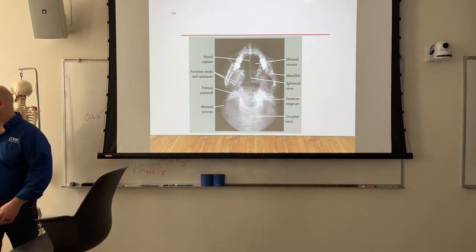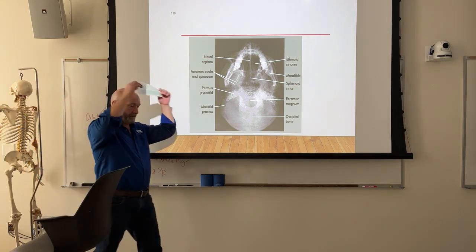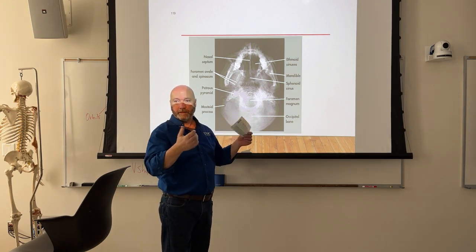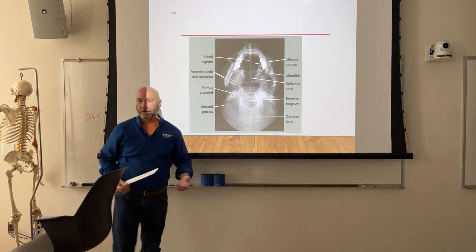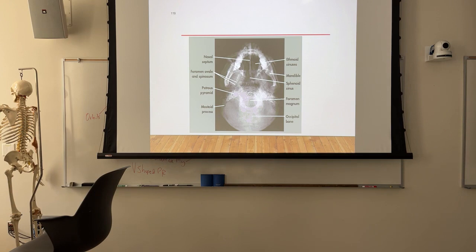Pretty much what they did was they took the x-ray film in a cassette, pointed the x-ray tube straight up at the ceiling the best I could, and just had the patient lean out over it. Don't try that. It didn't work. It didn't even come close to working. It was awful. So again, in my experience, the easiest way, and the safest way, to do these is put the patient in a chair up against the wall bucky, providing the patient can tolerate it.